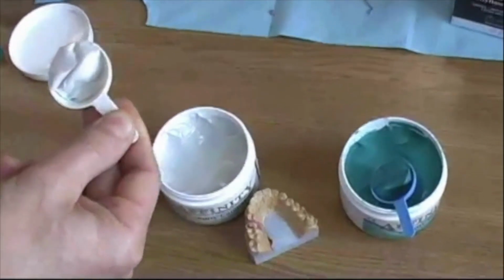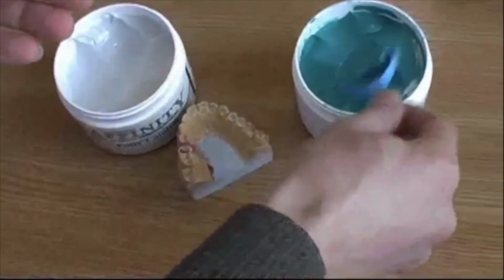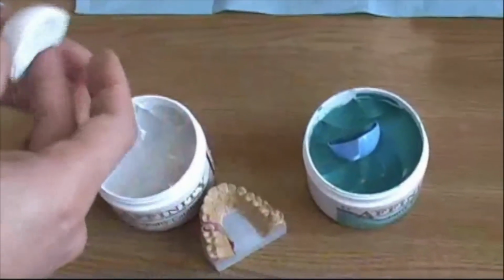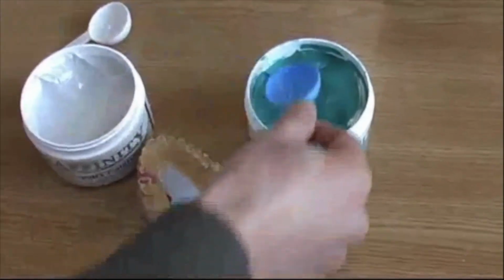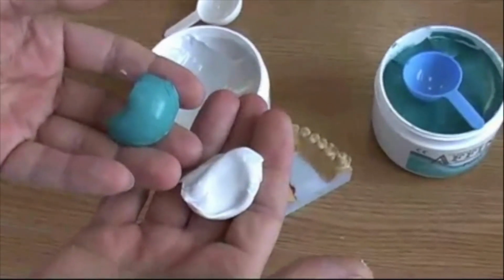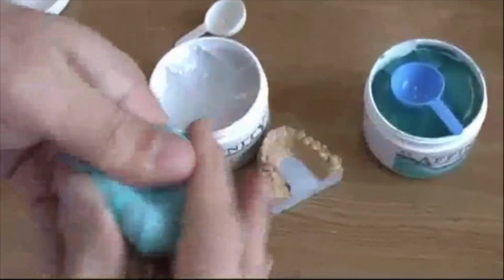You see, there are 2 spoons, because you don't have to have a little bit of white getting into the color. That's a little bit of catalyst that goes into the base, because it will catalyze your whole base and you have to throw it away. So keep it color for color, right? White, use only the white spoon. For the color, use only the color spoon. And you have the 2 together and you mix them now. This is addition type silicone again. Putty, addition type silicone. That's the first step of the impression.